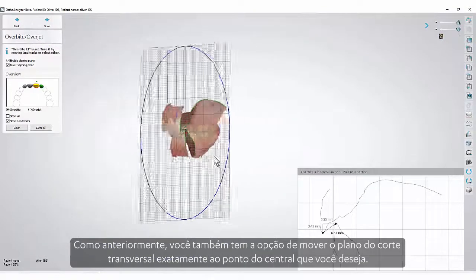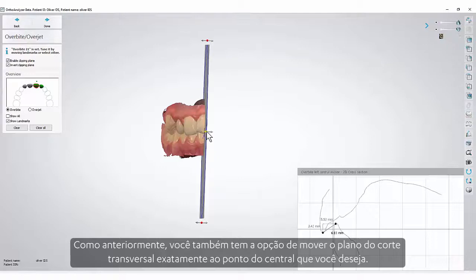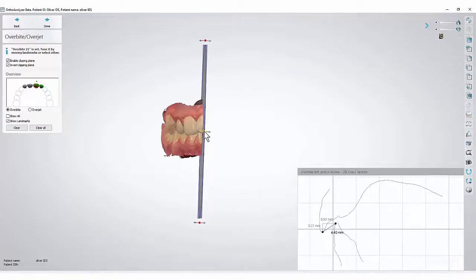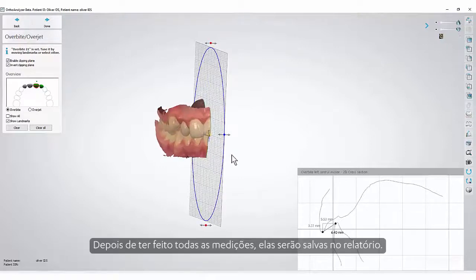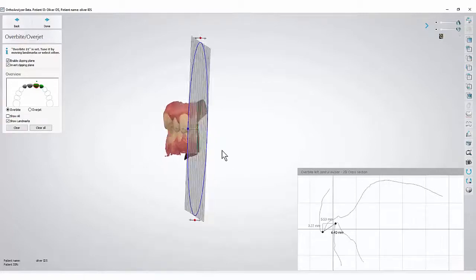As previously, you also have the option to move the cross-section plane exactly to the point of the central that you wish. Once you've done all the measurements, they will be saved in the report.